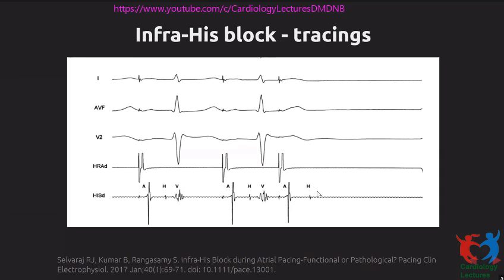So we consider it pathologic HV block when it happens without abrupt change in cycle length. So if you just pace at a rate of say 70 beats per minute, go up gradually to 75, go up to 80, go up to 85, go up to 90. And at some point during this, if you see infrahisian block, then it can be considered an indication to pace. So don't be very aggressive in pacing patients for pacing-induced infrahisian block unless you are sure that it is not physiologic.